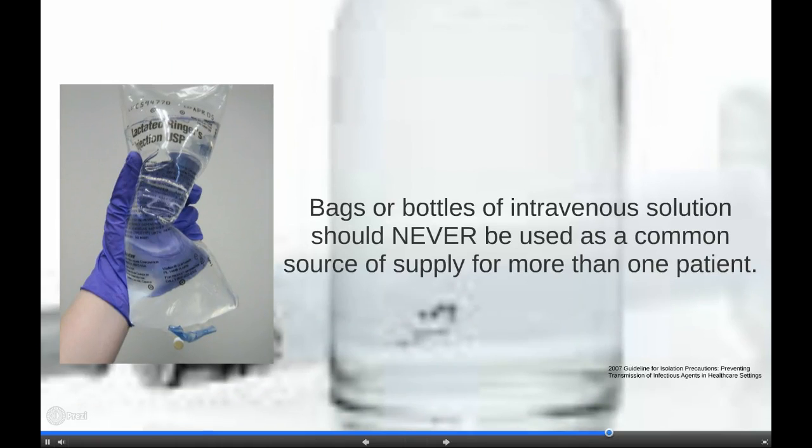In addition to single and multi-dose medication vials, intravenous fluids can also be a potential source of infection. Bags or bottles of intravenous solution should never be used as a common source of supply for more than one patient. Fluid infusion and administration sets, that is, intravenous bags, tubing, and connectors, are to be used for one patient only and disposed of properly after use.